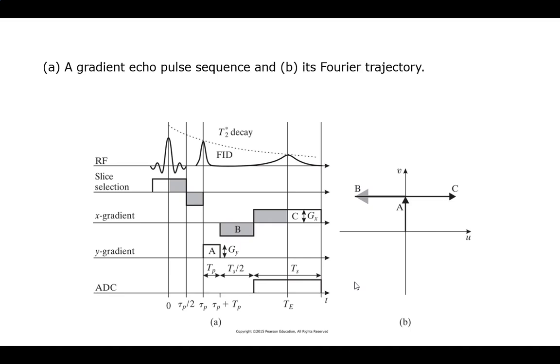I now want to be able to get spatially off axis. So I want to read some height, right? So the slice will determine here, y direction, how far out or back from my center line. That's determined by this, because I'm setting that dephasing on them. It shifts me up in direction. I want to read the whole line, not just half a line.